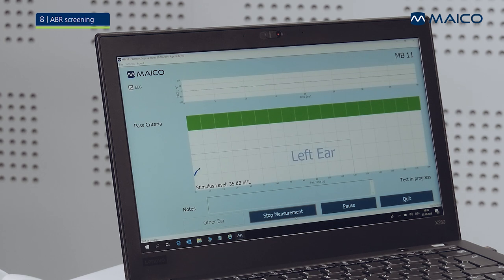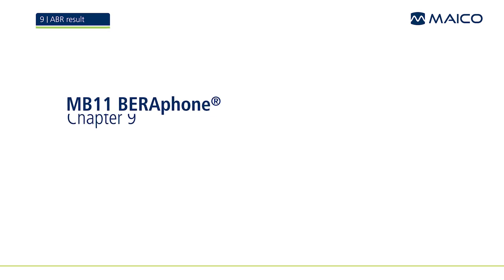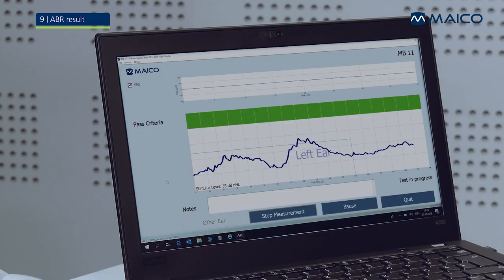The test progress is displayed on the measurement graph. During the test, the progress line in the diagram continues to move upward on the graph until the green area is reached. When the pass criteria are fulfilled, the test ends automatically with a pass result shown in the green area. If the pass criteria are not met after three minutes, the measurement stops and the result is a refer. The measurement might stop earlier if the detected responses are too poor.